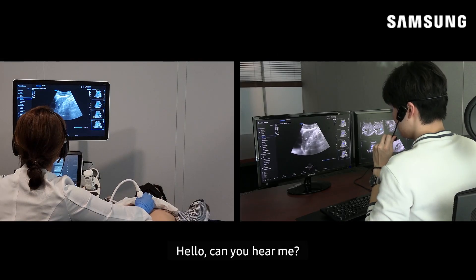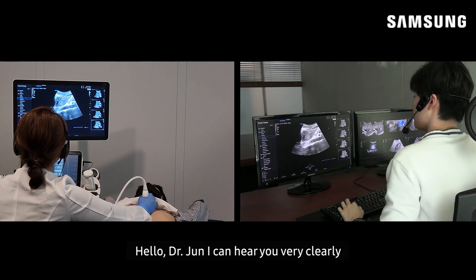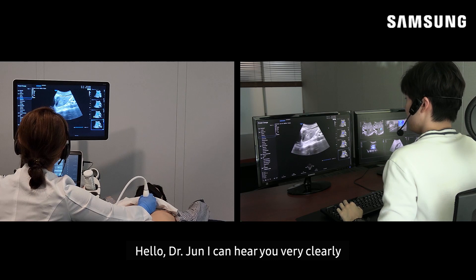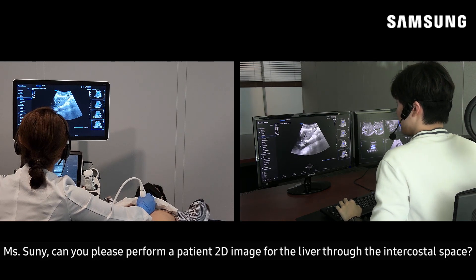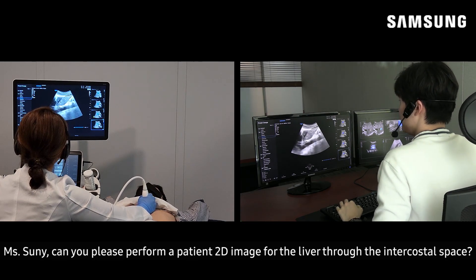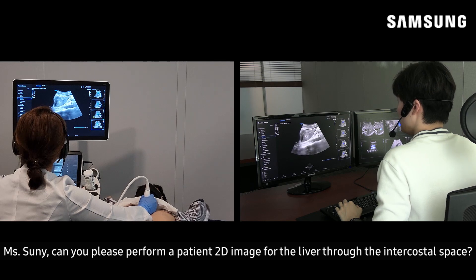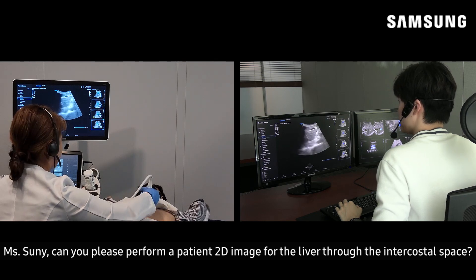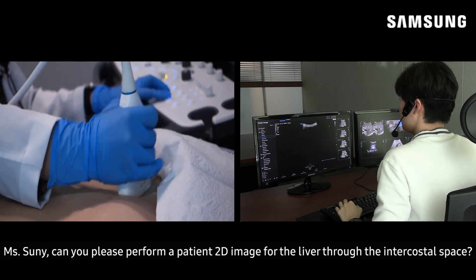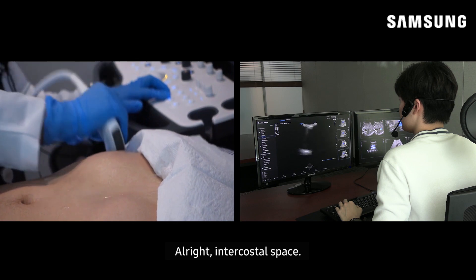Hello, can you hear me? Hello, Dr. Jun, I can hear you very clearly. Alright, in that case, Ms. Sunny, can you please perform a patient 2D image for the liver through the intercostal space? Alright, to the intercostal space.